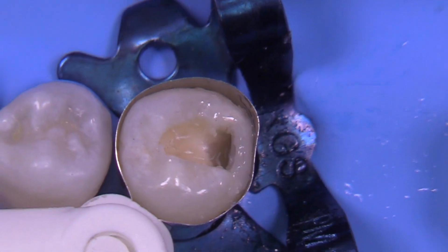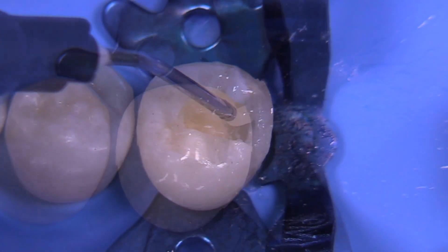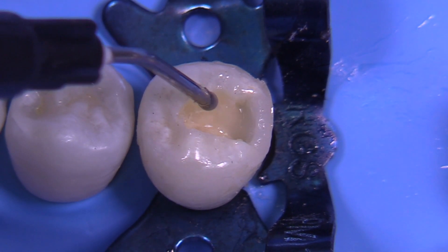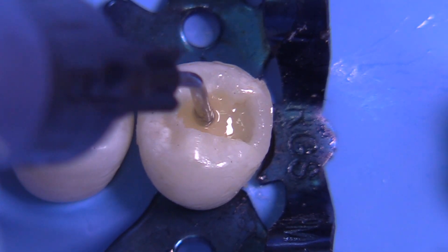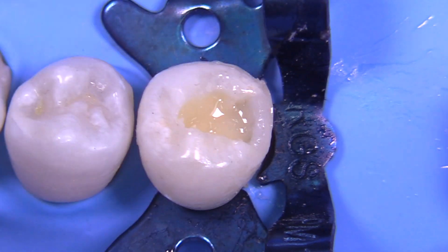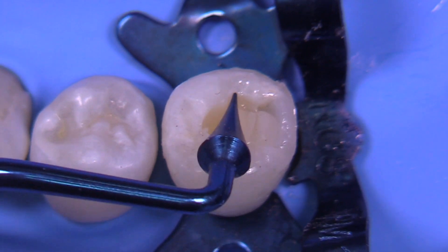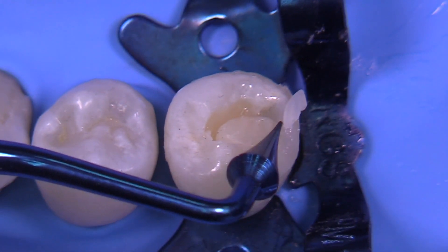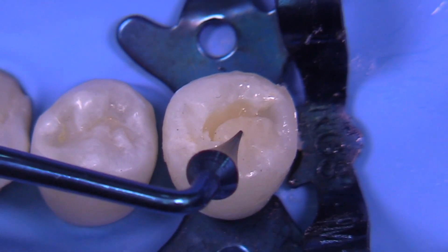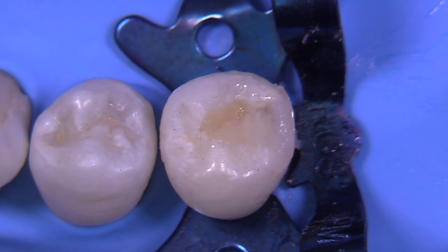You can follow the links provided in the video later. I have a hard time marketing things that I make — I feel a little embarrassed by it — but at the same time, if it's good we should share it. Here we're using the TR12 — this is curvilinear, the only one of its kind. No one has made an instrument like this that works with composite. It's curvilinear so it's not straight; it's shaped so that it'll help create the triangular ridge three-dimensionally.